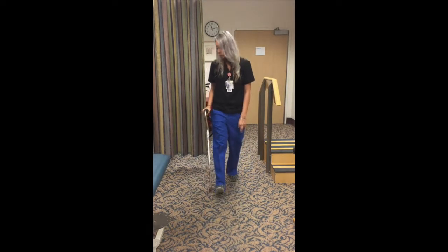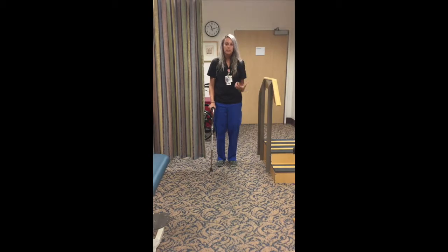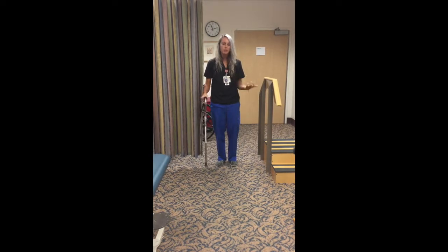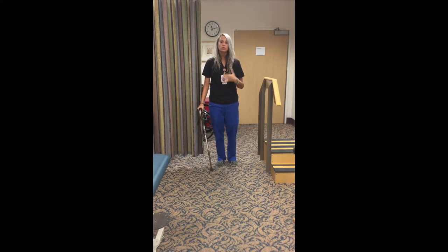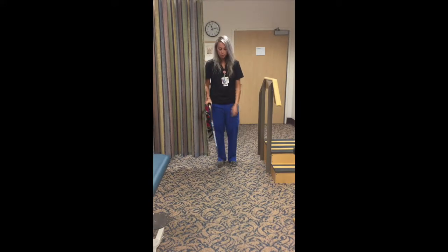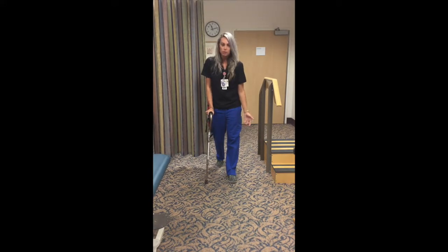Okay? For most people, this is the hardest part to get down because it can be a little bit awkward or it just feels like they don't have enough support. So that's when we'll be there coaching you, or we'll make sure we have a hand on you to make you feel a little bit more secure. We won't change you to the cane if we don't think you're ready.